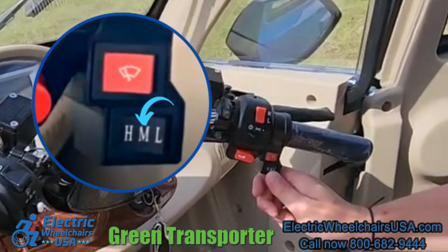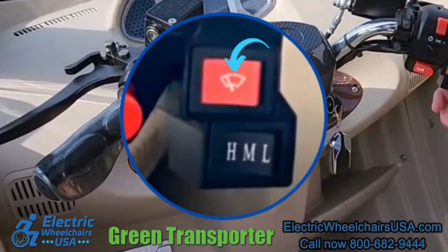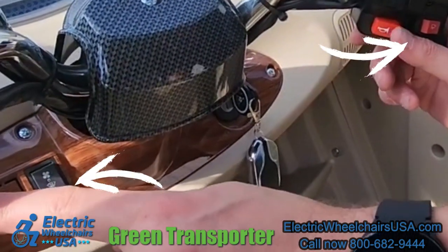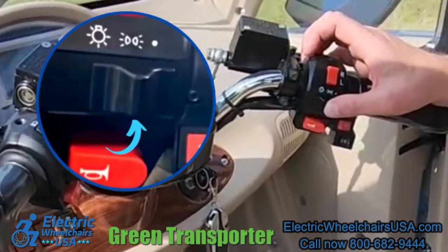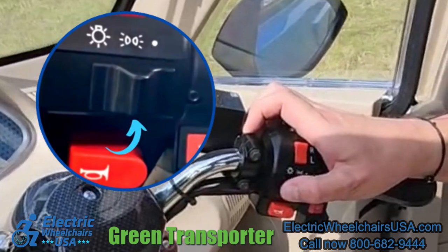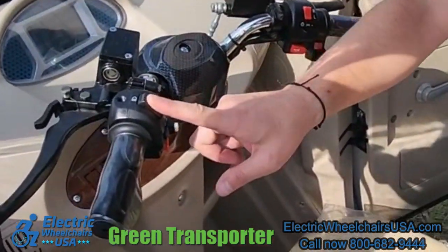This is the speed control dial — you have high, medium, and low. This red button is the windshield wiper on the front. These two red buttons are the horn, one on each side. You have your headlights, your left and right blinkers, hazard lights, and right above that your high beam and low beam.